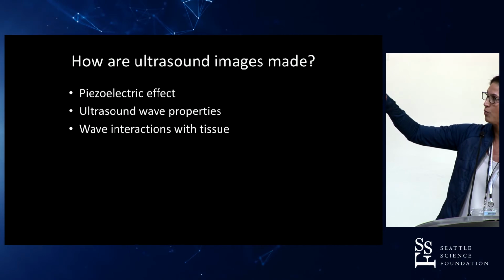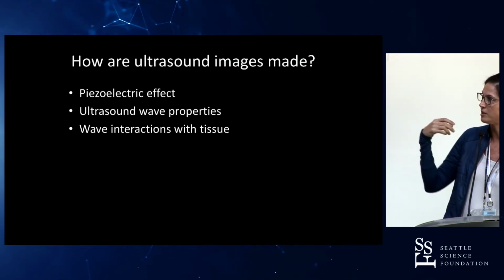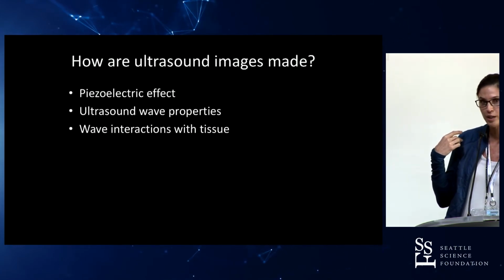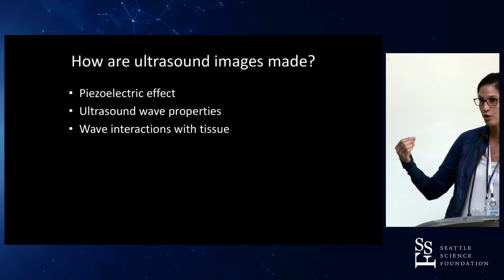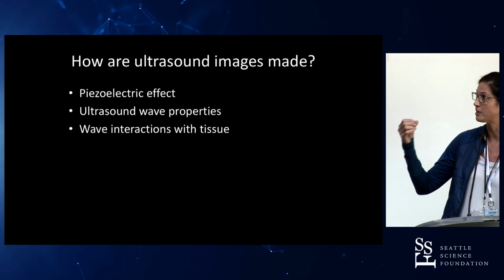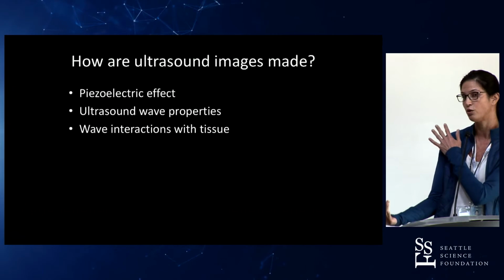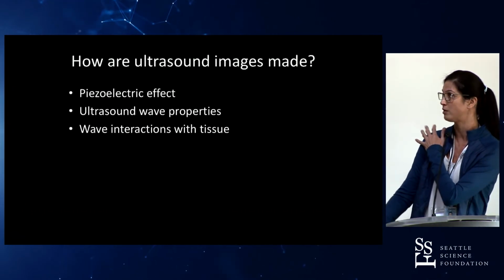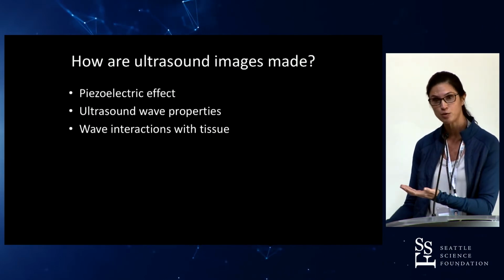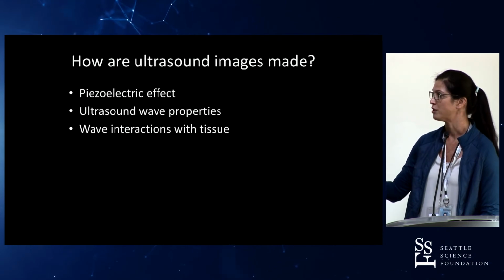Other potential uses: we use it for musculoskeletal ultrasound. Up on the top with a white line around it is a supraspinatus tendon. So it's great for shoulder evaluations, with super high spatial resolution, equivalent essentially to most MRI, if not better than some MRIs, for the tissues that we can see. Again, we can't see past bone, so we can usually evaluate part of the rotator cuff very well, particularly supraspinatus. And it's dynamic, so you can look for rotator cuff impingement, tears, effusions, things like that.